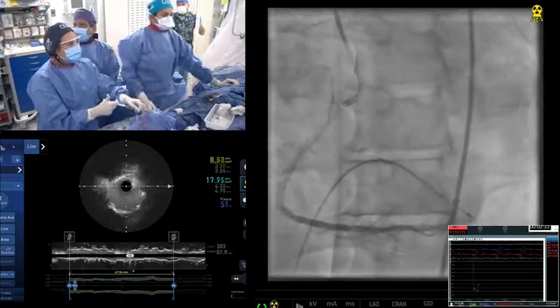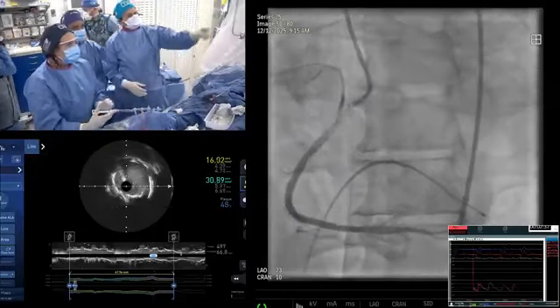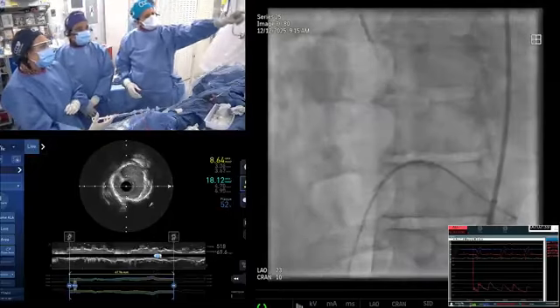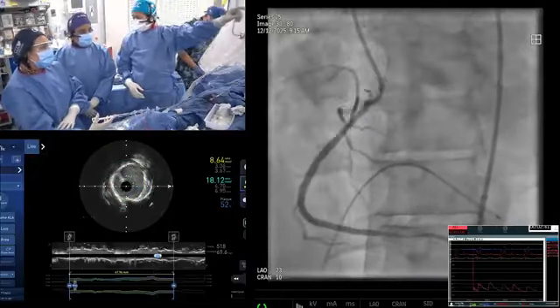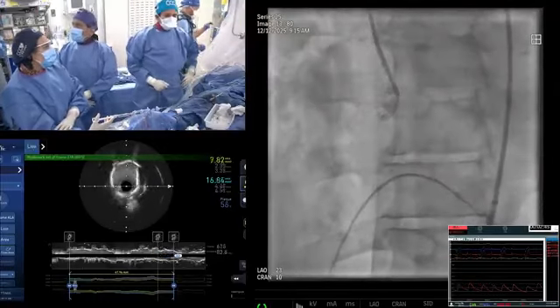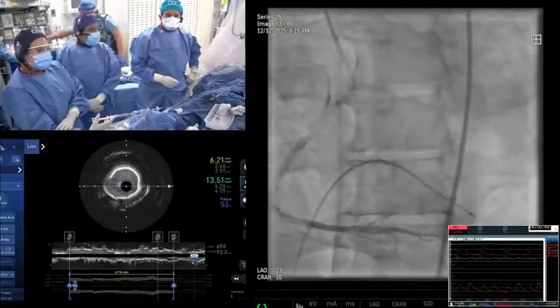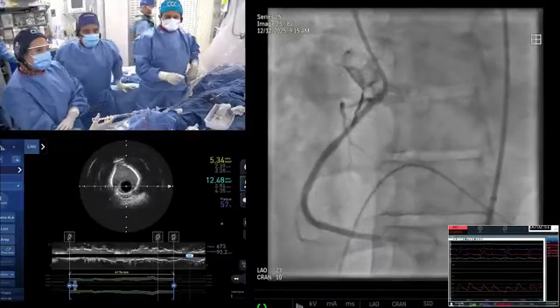Wow. Beautiful. All the branches are still there. There's a tiny branch at the level of the lesion. Look at that, it's gone. No, it's still there. It's coming back. Coming back. So everything looks very good. Can you stop the pacer? Switch off. Let's see what happens.